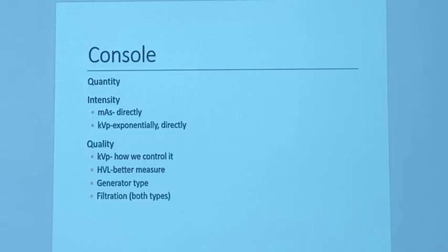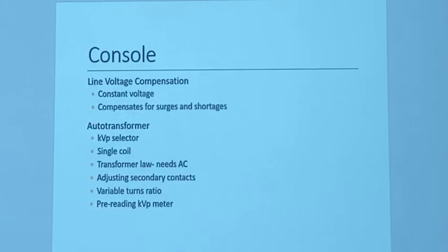You may have wedge filters and trough filters and things like that. And realistically, have y'all seen any kind of added filters? Any kind of compensating filters in clinicals? In a lot of ways, the digital processing has kind of replaced that. They still do have applications, but they're not as critical as what they were with screens and films. In order to get a good image of the foot from a toe to heel, whenever we're using screens and films, you had to use a wedge filter. You just don't have to do that anymore. So it's almost theoretical. It still does have an application, but it's almost theoretical.